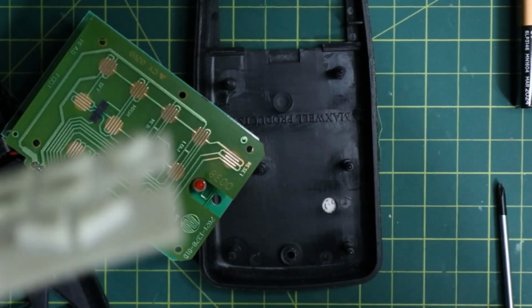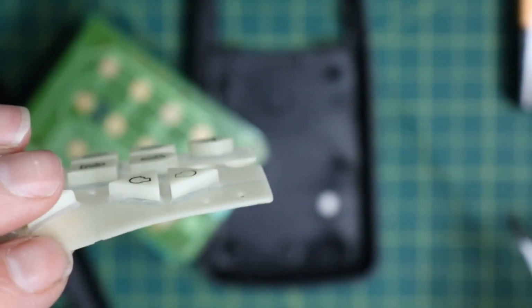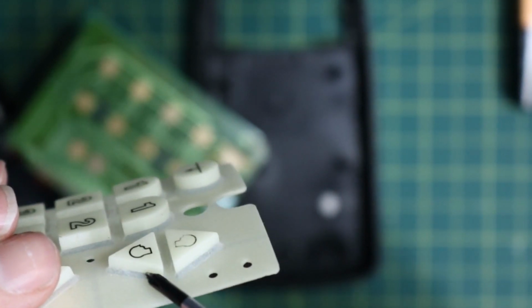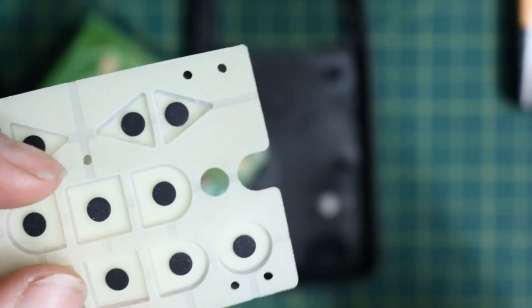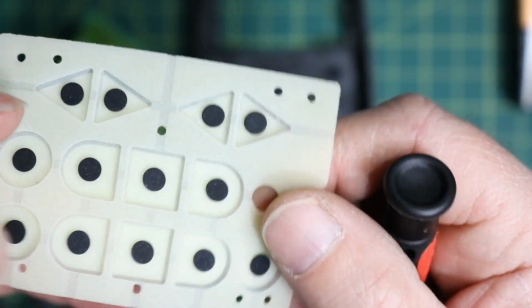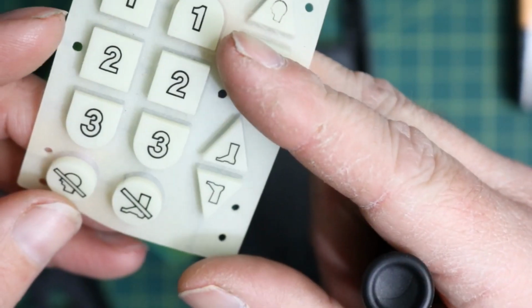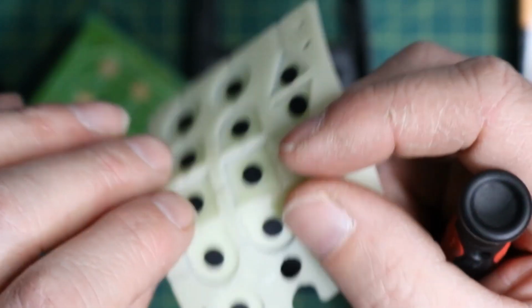So, let's get that in. And I'll get that focused up here, and you can kind of see the little slit right there along that there. So this is going to be the only thing I can think that's going to cause future issues with these controllers. The pads on the bottom here, they look like they are in great shape. Like I said, I did clean this a while ago, and it should be pretty good. So let's go ahead and get the IPA out and get this all cleaned up.